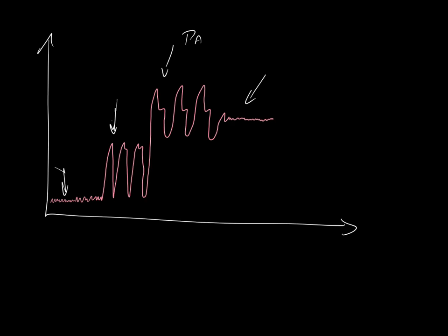When do we zero our invasive lines? Patient position, patient movement. At altitude. Major moves and changes in altitude. And generally speaking, there are at least three times that we're going to have to zero. We're going to have to zero at patient contact, zero at altitude, and then zero once we land. All right, good. I think we're good there. What do you guys think? Does that seem like we've hit some of the major stuff that we need to talk about?